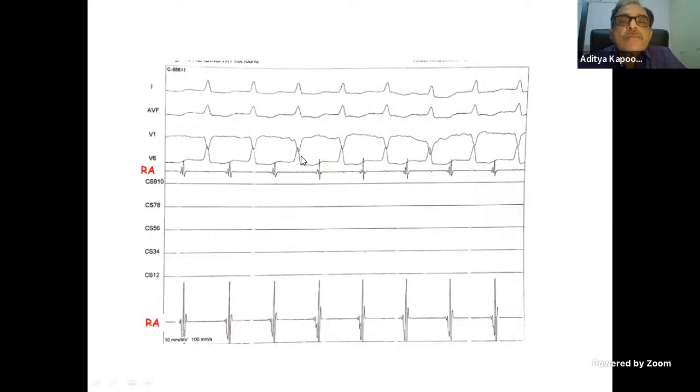Supposing you have this tachycardia, your consultant has asked you to start a procedure, you are putting in catheters, right? And a tachycardia gets induced. So a good way is to just put a catheter in the RA and see what is the V and A relationship. So Umesh or anybody, would you like to tell us?